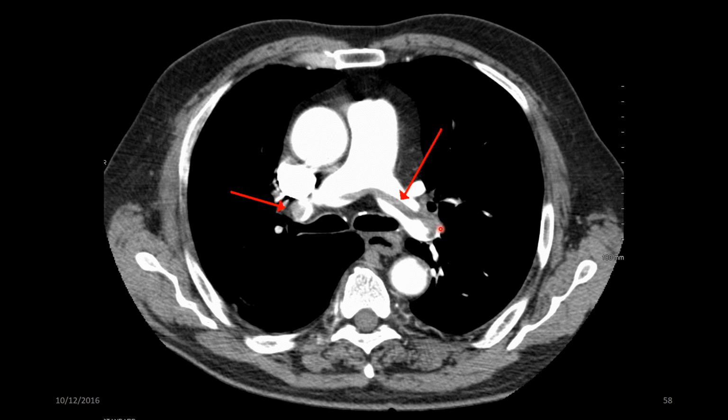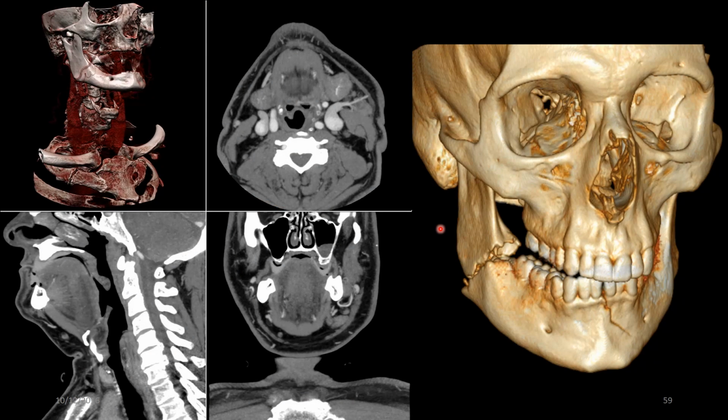So, one other cool thing about CT data, it scans in the axial plane, it acquires a shed load of slices. The average chest-abdo-pelvis scan is usually about 1,500 slices that you can scroll through. And then it reconstructs them in various different planes. But I was talking about the reconstruction. Because these slices are so thin, you can stack the slices together and create a 3D rendering of whatever you're looking at. So this is showing a mandibular fracture.